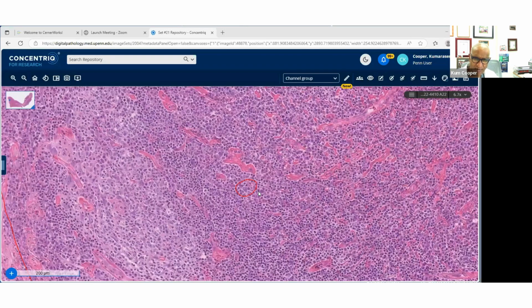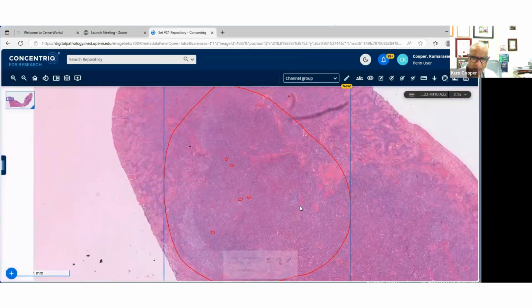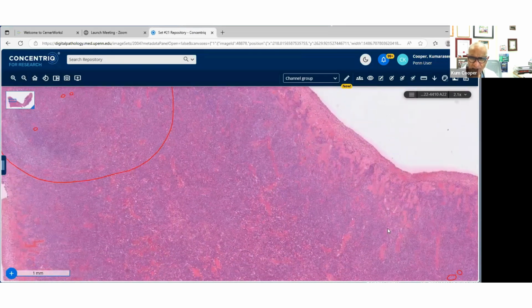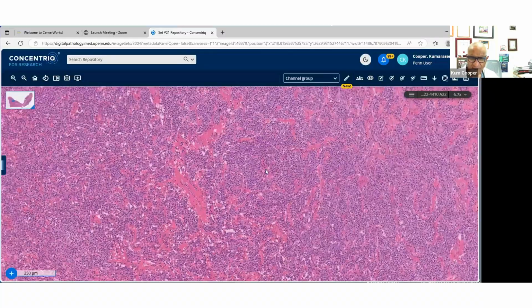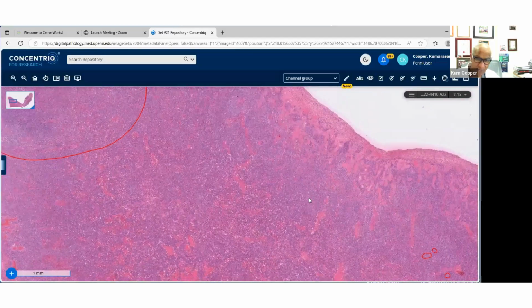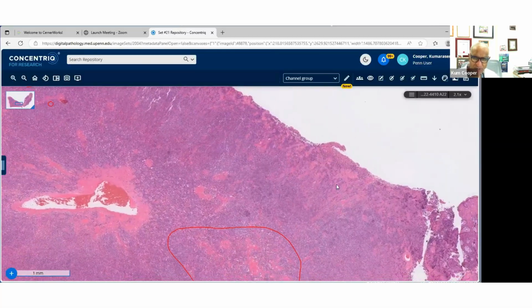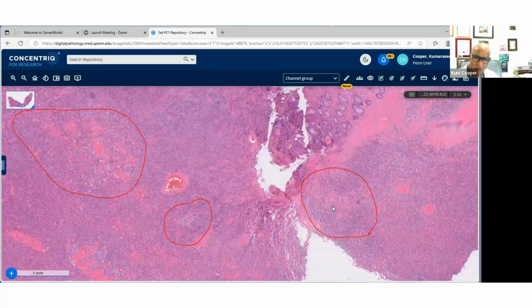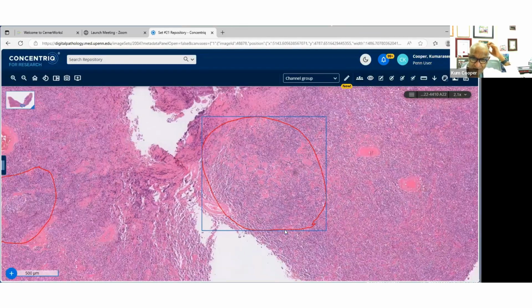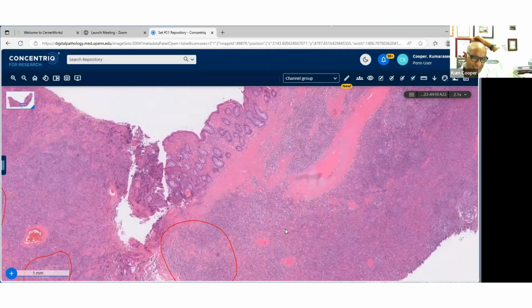This case was shared with me by a hematopathologist, for which I was very grateful. Vinod Pillai, who's one of our hematopathologists at CHOP, shared this with me a while back. And the stain that you want is EBV, Epstein-Barr virus, and the in situ hybridization that we have for EBV was positive in those large cells. In fact, there are far more of those large follicular dendritic cells than meets the eye on H&E. And so this is an EBV-associated inflammatory variant of follicular dendritic cell sarcoma.